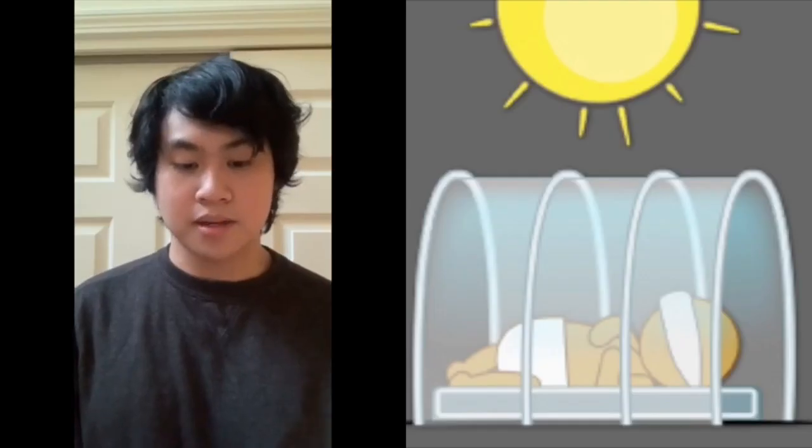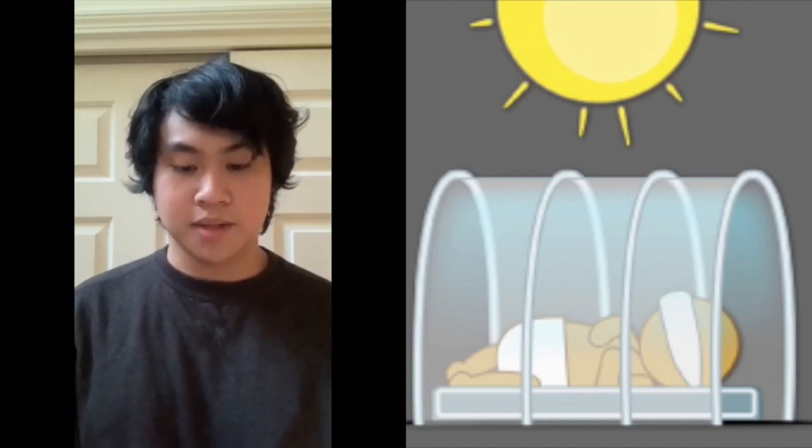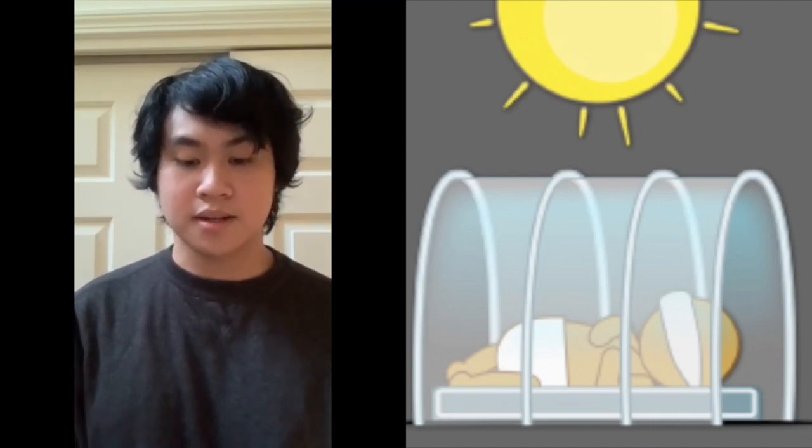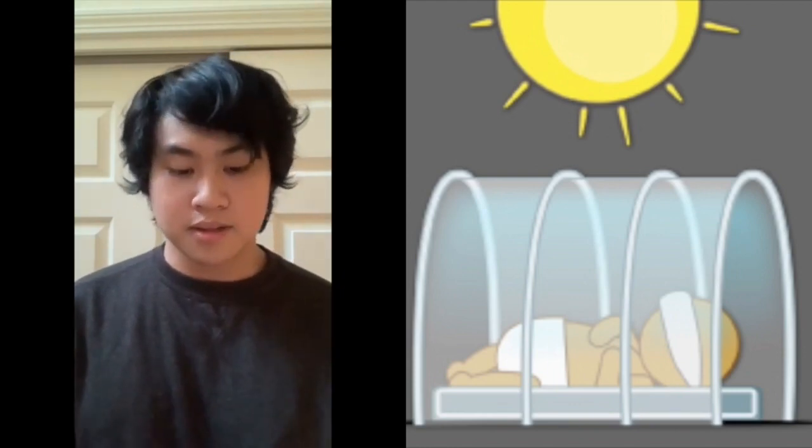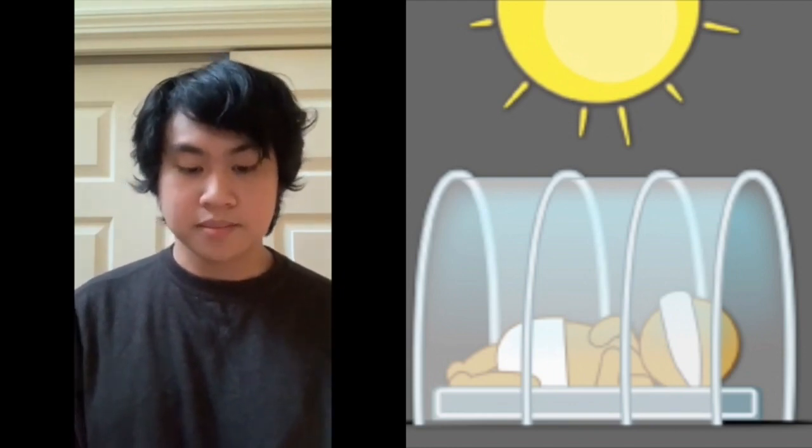The idea for Bili-Balloon stemmed from our research into developing countries with high rates of jaundice, namely Myanmar, Egypt, China, and Nigeria. Of all the countries, we found that Nigeria had the most innovative treatment methods. One that caught our eye was sunlight-filtered phototherapy. A research study from the New England Journal of Medicine found that filtered sunlight was efficacious on 93% of treatment days that could be evaluated, as compared with 90% for conventional phototherapy. Additionally, hypothermia, dehydration, and sunburn were not an issue during these trials.